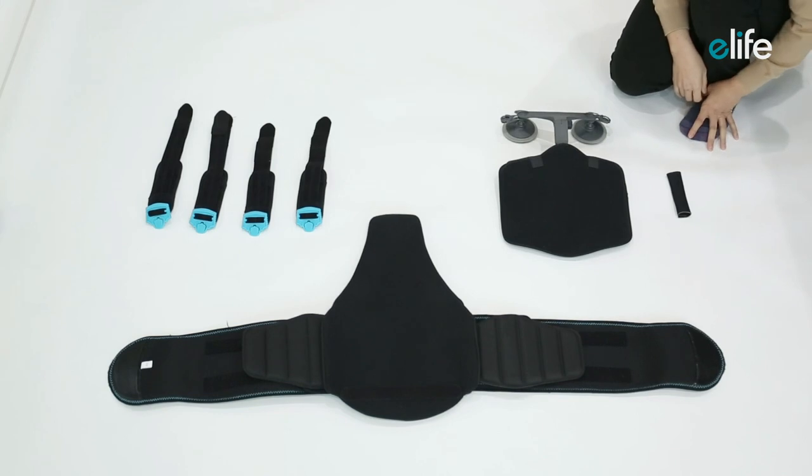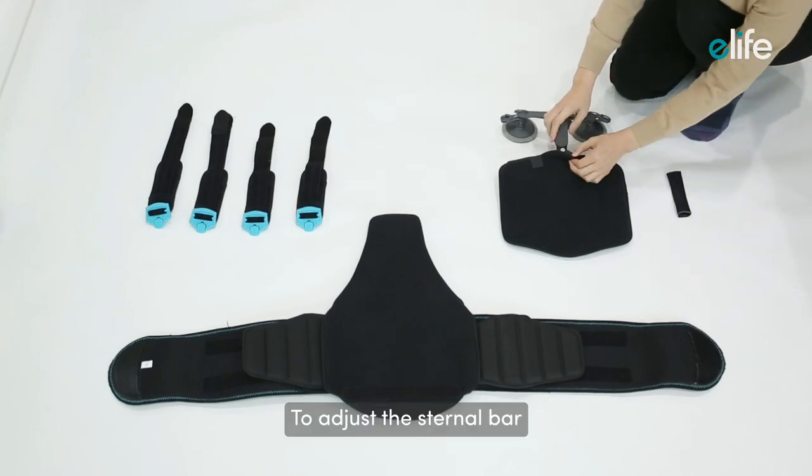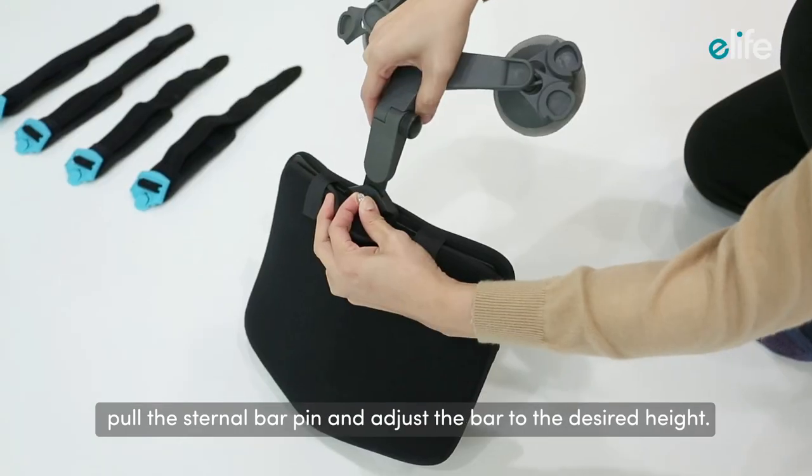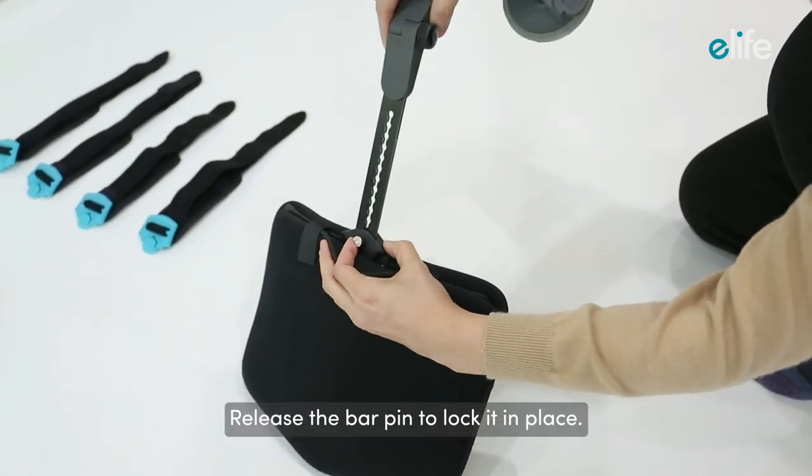Repeat those steps on the other side. To adjust the sternal bar, pull the sternal bar pin and adjust the bar to the desired height, then release the bar pin to lock it in place.